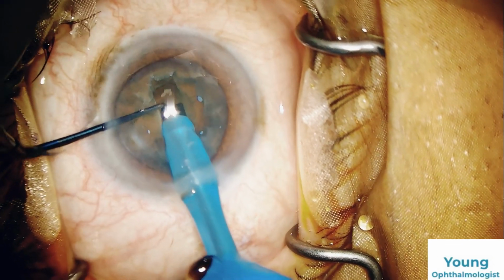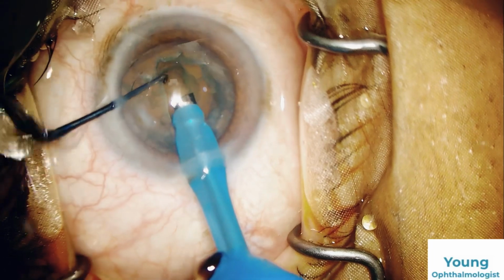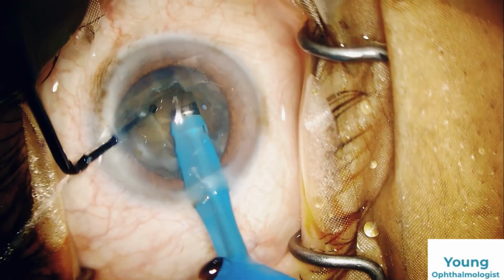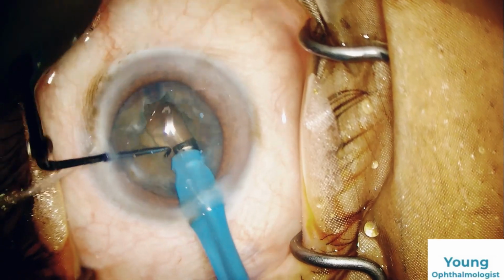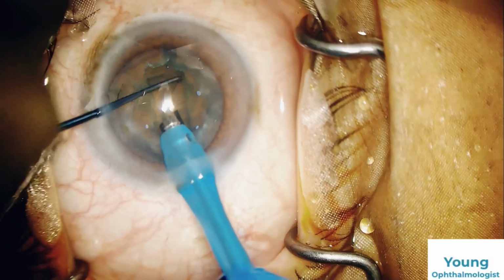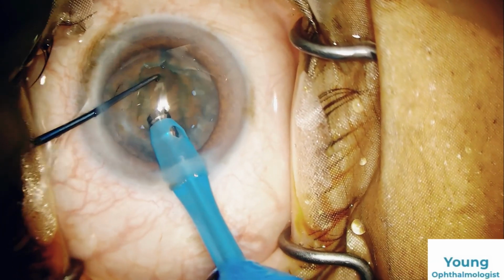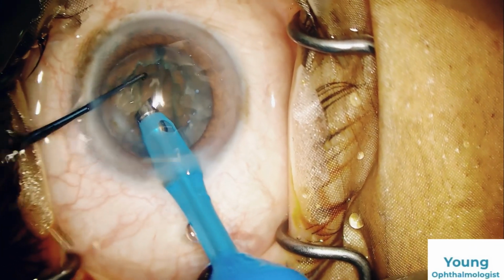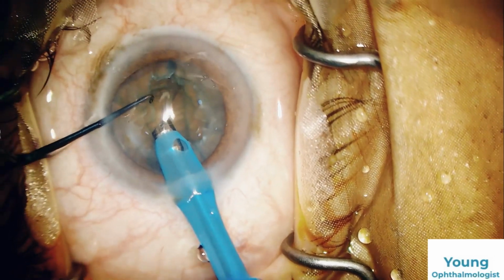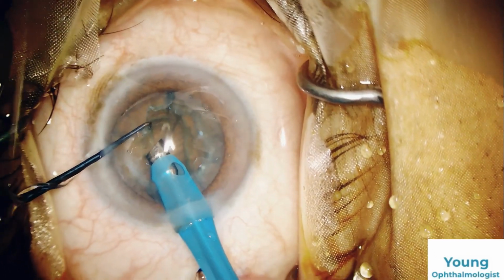You can rotate the nucleus also to complete the trench, dividing into two. Both the handpiece and the dialer are in the depth of the trench. Got the break. Now shift it to Phaco 2. Each hemisphere of the nucleus will be prolapsed towards the center and will be emulsified.